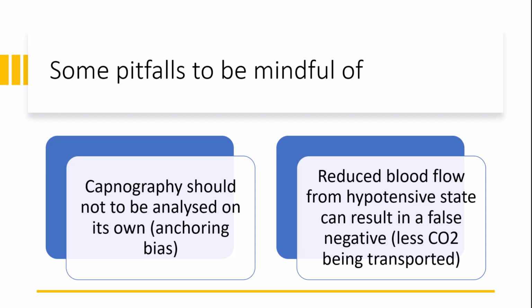Because if we put end-tidal on and it's lower than 25, there's an increased respiratory rate, that's a Kussmaul breathing pattern, we could be more concerned that this patient is in a state of metabolic acidosis caused by severe infection, and the serum lactate levels could be greater than 4, which means that if we don't do something now, the patient will have a bad outcome.